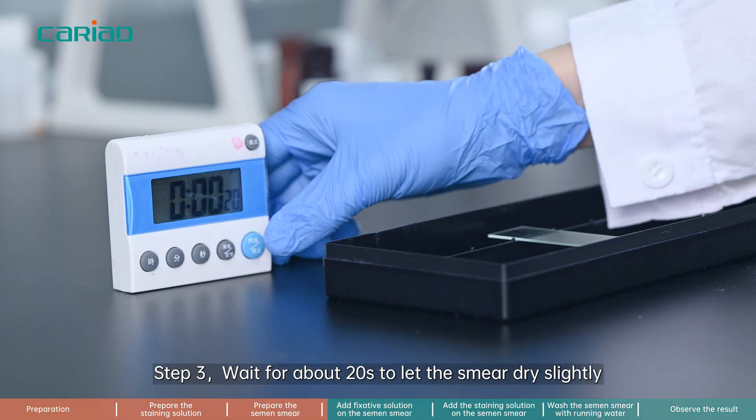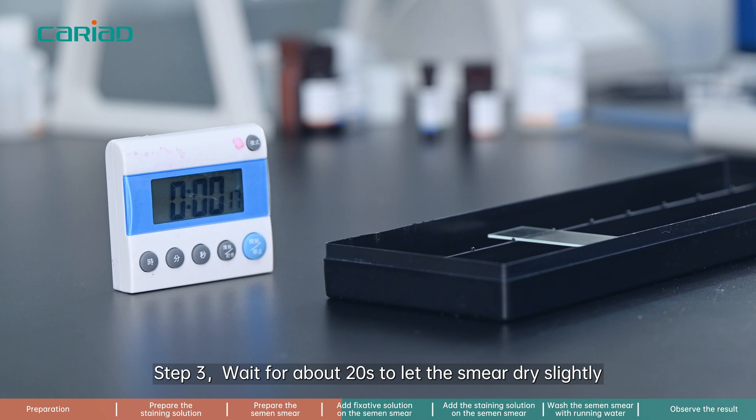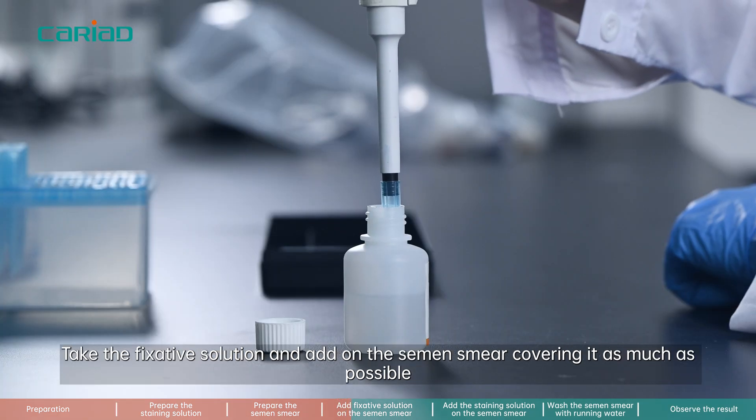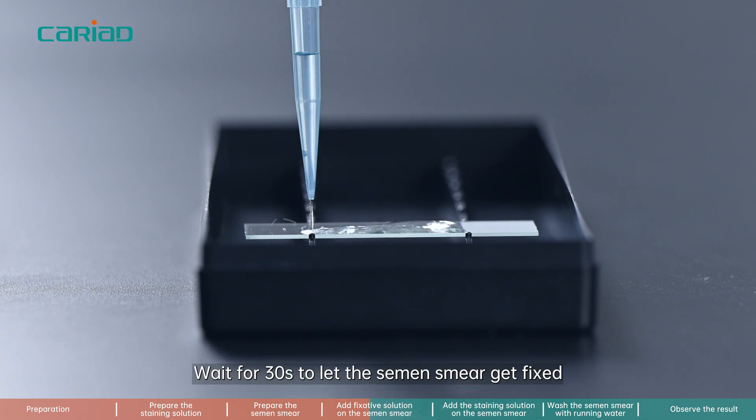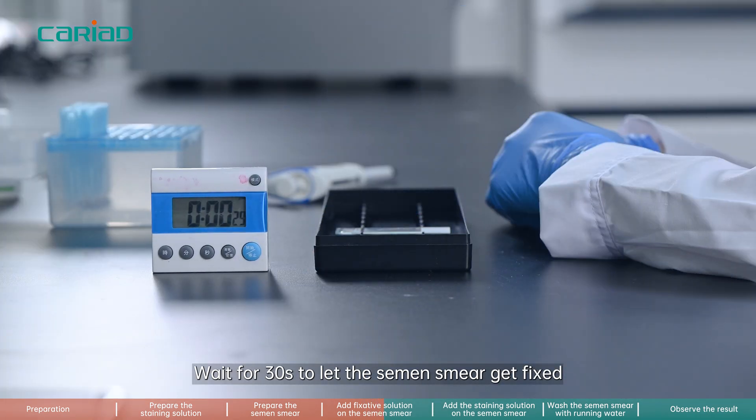Step 3. Wait for about 20 seconds to let the smear dry slightly. Take the fixative solution and add it on the semen smear, covering it as much as possible. Wait for 30 seconds to let the semen smear get fixed.